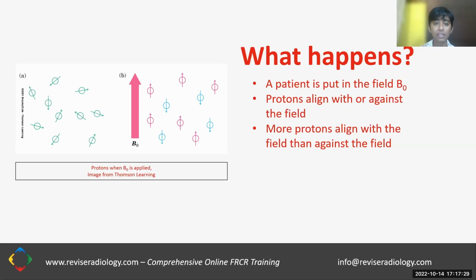And the reason for that is that the magnets we're talking about here are quantum magnets. So we have to expect them to behave in ways that are different from classical magnets. That's kind of a hand-wavy explanation, but we'll talk about what it means for magnets to align in 2 different directions in just a second. But the answer is that it's a quantum magnet and there are quantum effects at play, which cause the alignment of the field to be one or the other.